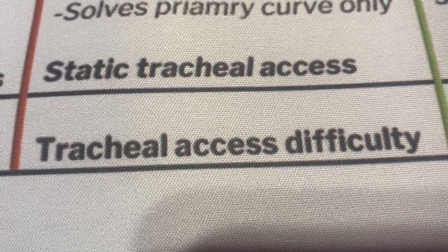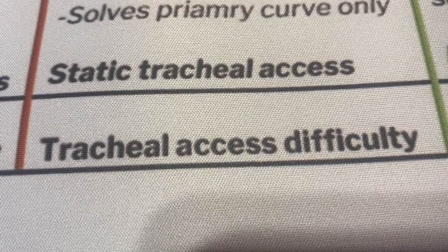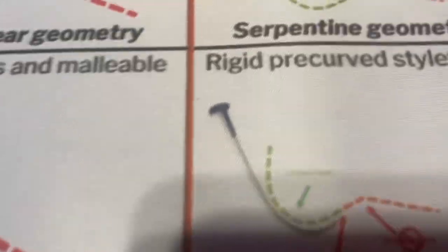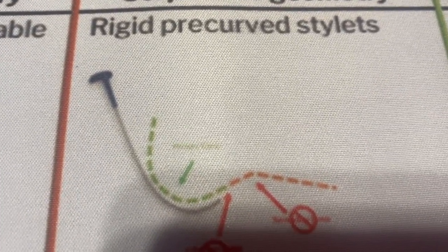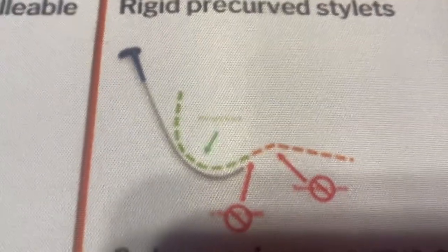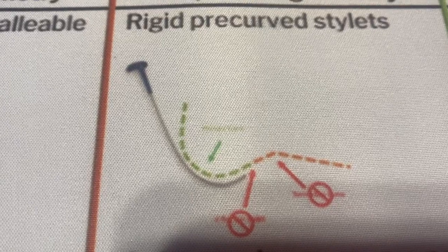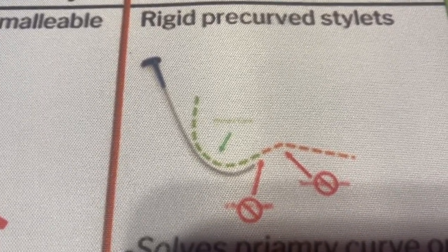The video laryngoscope intubation systems fail because of tracheal access. And that tracheal access failure is because we have a partial evolution of tracheal access equipment. It can only be bent in an anterior fashion. The place we're failing now is the secondary curve, being able to turn posterior down the airway.